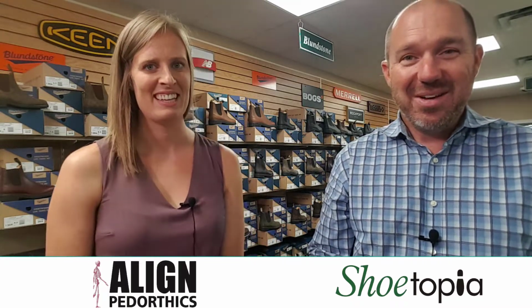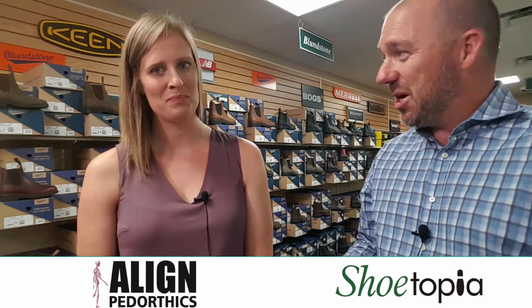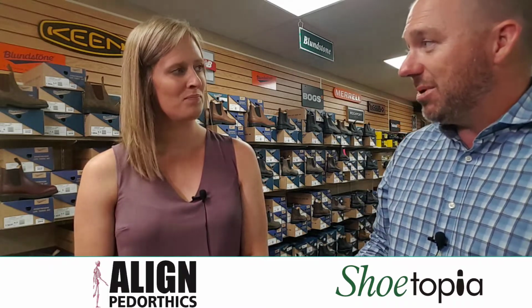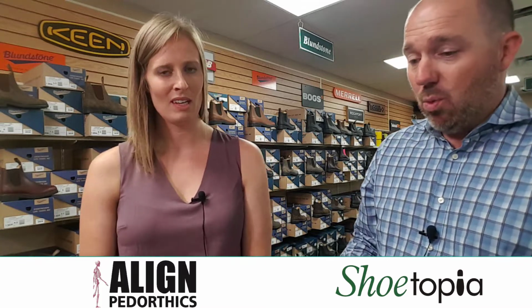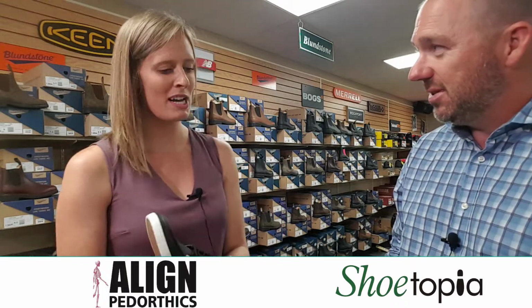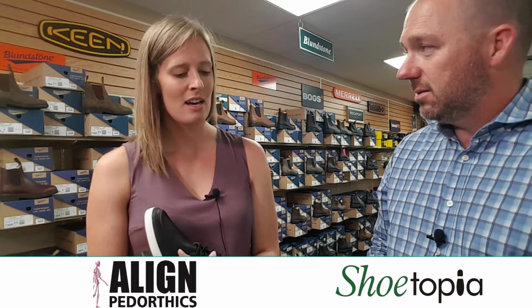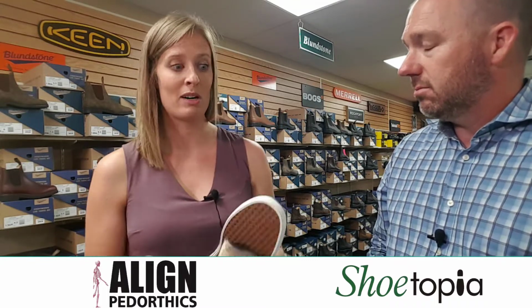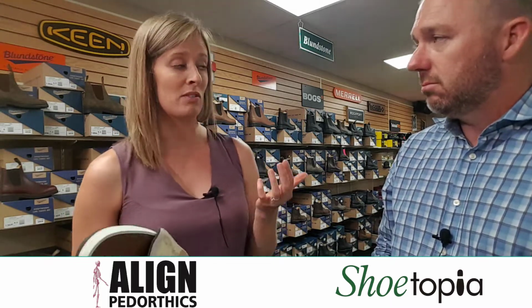And today we're going to talk about orthotics. So pretending that I've just come in to see Laura, I've got sore feet, and we've determined that maybe it is time that I'm going to get into orthotics. So what do I expect when I'm getting my first pair of orthotics? So if I've taken a cast of your feet and we've decided it's time to go ahead with the orthotics, basically what I want to do is look at your current footwear and maybe some footwear that you want to wear or some good options for you to wear and determine what style of orthotic is best for you.